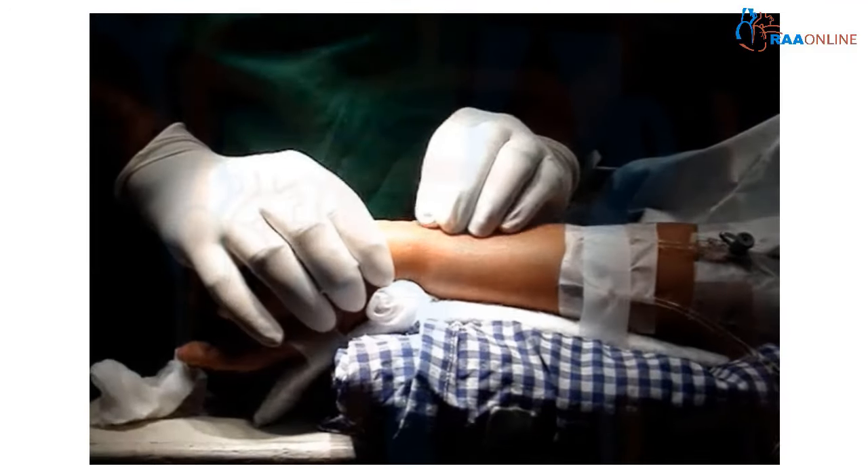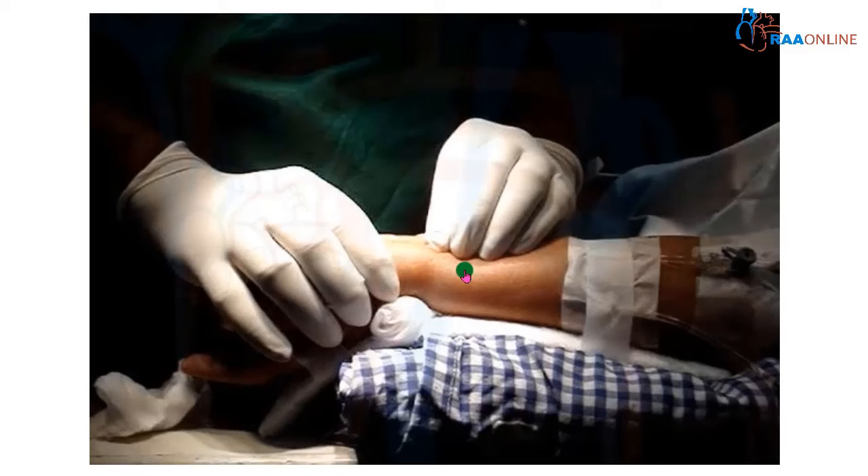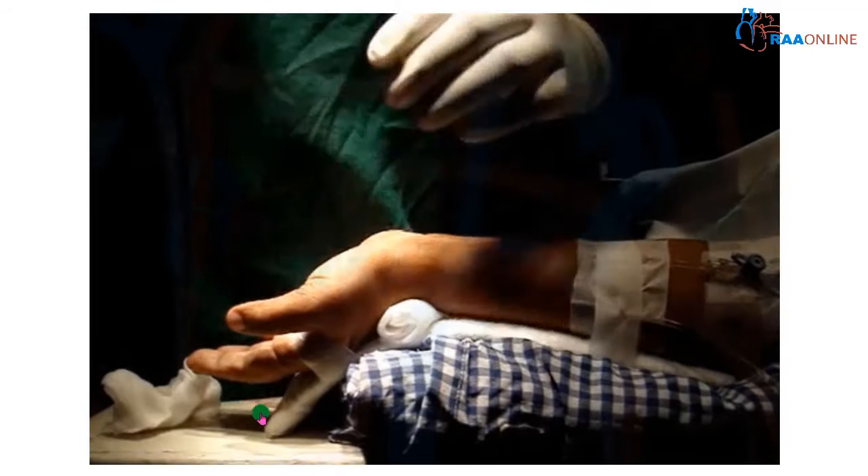Next, you have to take time to palpate the artery. You have to feel the artery and assess the depth mentally, taking at least 30 to 40 seconds feeling the artery, so you have a gross mental picture of how much depth the artery is located. Here you are feeling the artery.